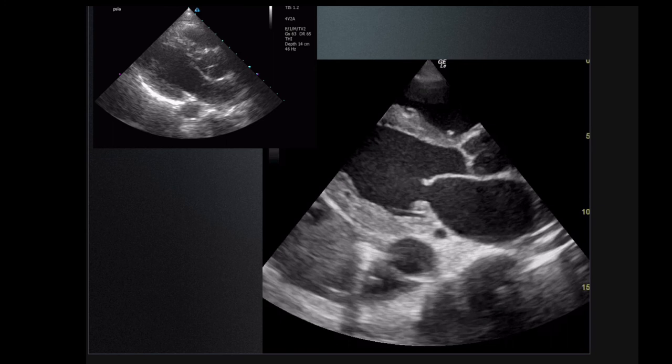When teaching, I try to have a normal reference and an abnormal at the same time so you can compare. Here you can see normal LV function on the left and clearly abnormal on the right. In this case you also get a complex pleural effusion — there's the descending thoracic aorta, no pericardial effusion, but a pleural effusion tracking back behind the descending thoracic aorta.